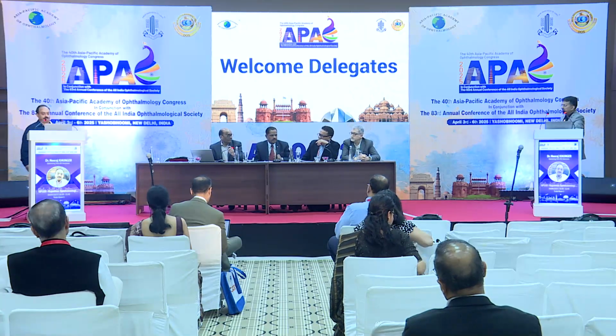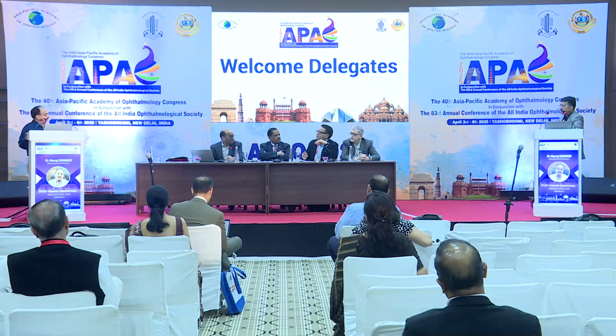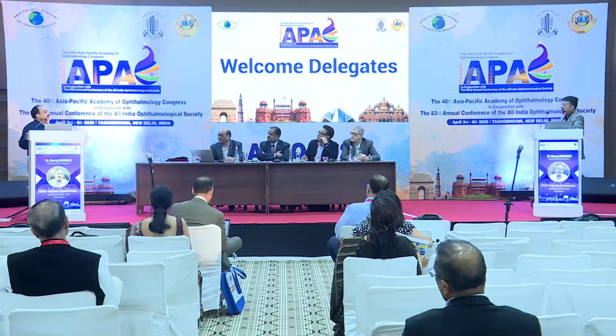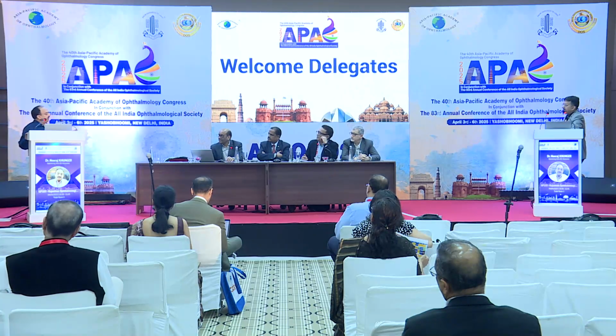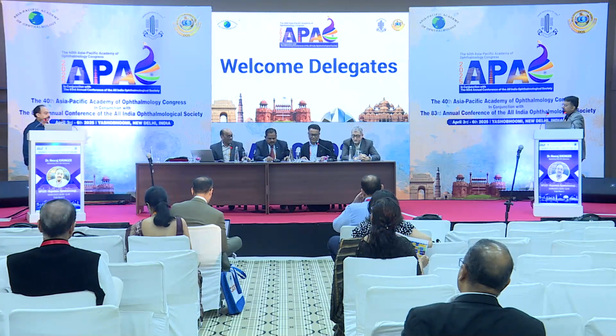Last question: what is your experience with toric IOL in irregular astigmatism patients? See, that is a talk altogether different. But what I'll say here is that in post-RK patients or where the astigmatism is stable, there it definitely helps and gives much better results than putting a normal lens. Right. Thank you, Dr. Neeraj, once again.